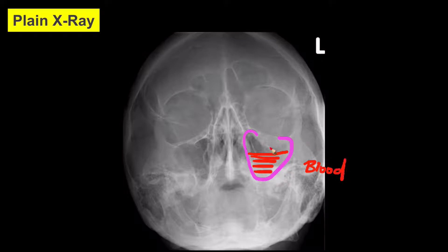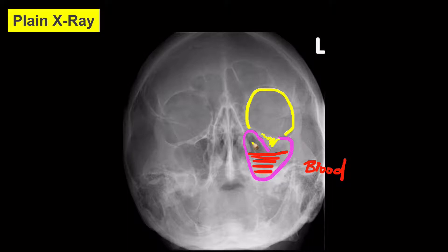The blood has pooled there because there is a fracture through the floor of the orbit. There is also a soft tissue shadow here that could represent the inferior rectus muscle herniating. Plain film radiograph is a limited assessment method, and more commonly we use a CT scan to assess for all facial injuries.